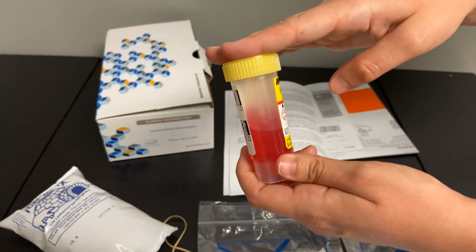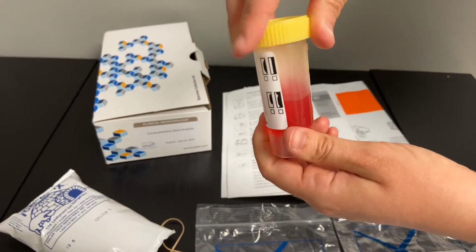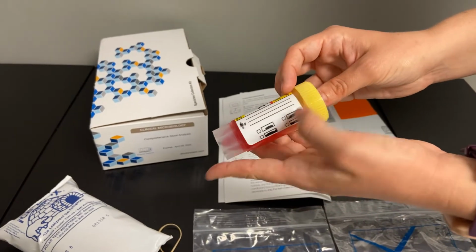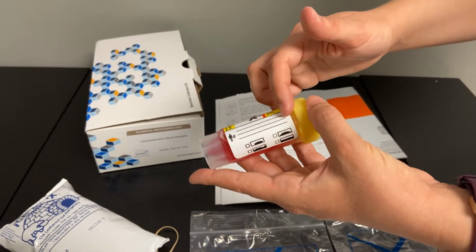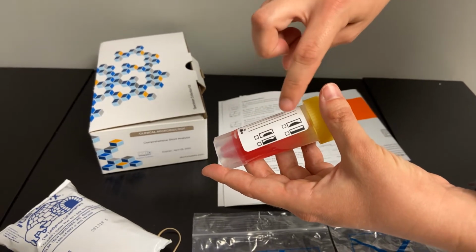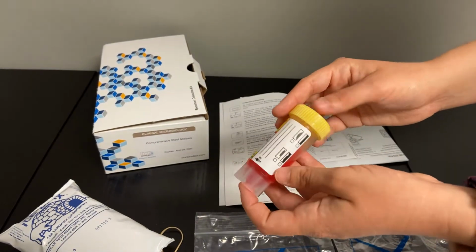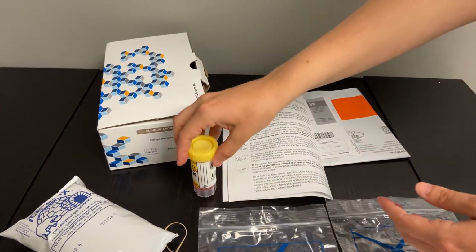Once you have collected those 3 sections of the stool and making sure that it's not overfilled, you'll twist this cap on very tightly. That's important because if it's loose, then it might leak, and we don't want to have to redo this test here. Making sure that you put your patient information with your name, your date of birth, the date and time that you collected it, as well as what the stool looked like. This first section here is more formed. It gets looser as it gets to the bottom right-hand corner, and finally that bottom right-hand corner is more of a liquid type diarrhea.